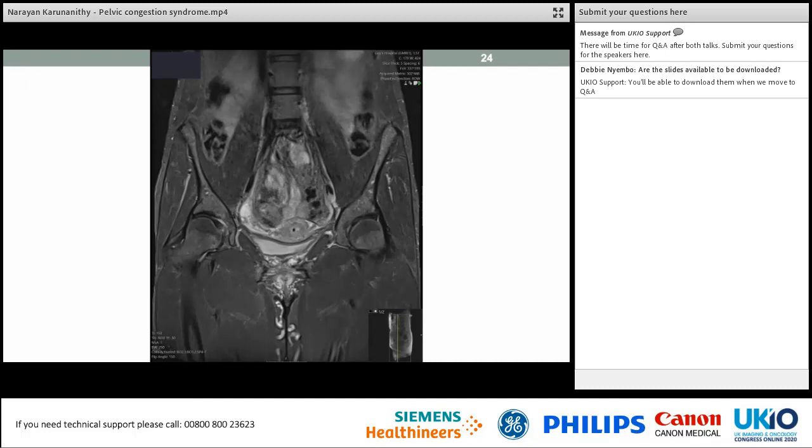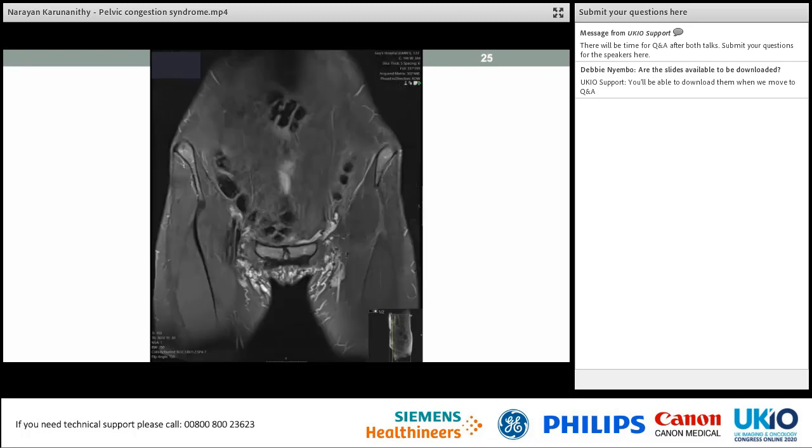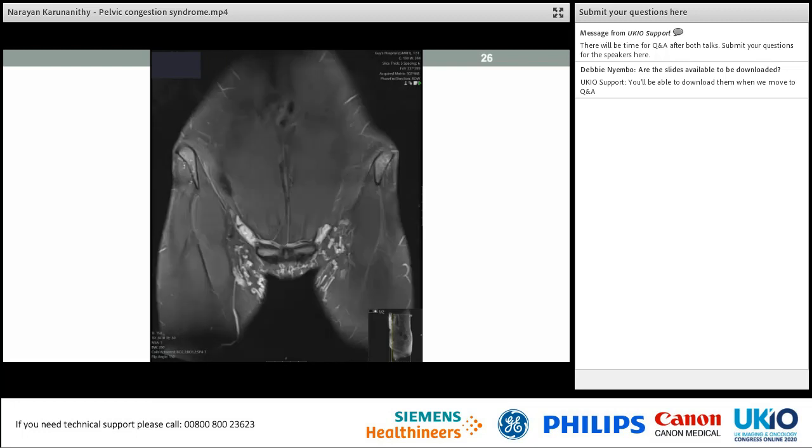This patient also, as we'd seen from the clinical photo, had dilated peripheral varices crossing the front of the pubic bone and extending towards the saphenofemoral junction. And this is more anteriorly. And there's a cross-pelvic vein superior to the pubis and multiple veins communicating with her saphenofemoral junctions.